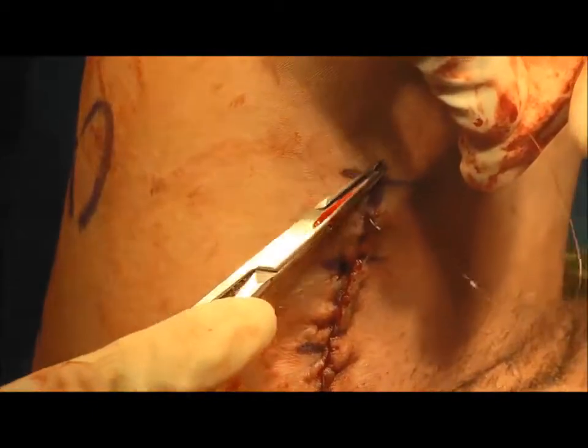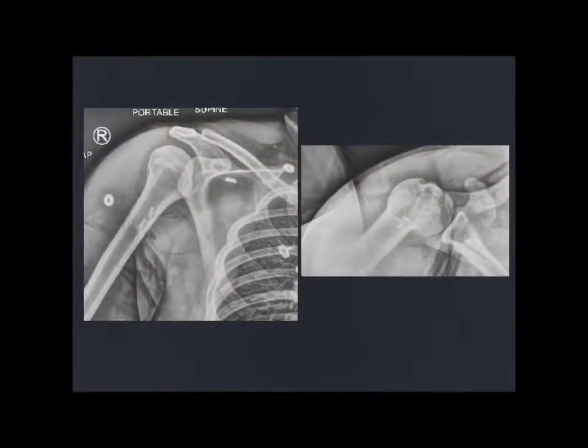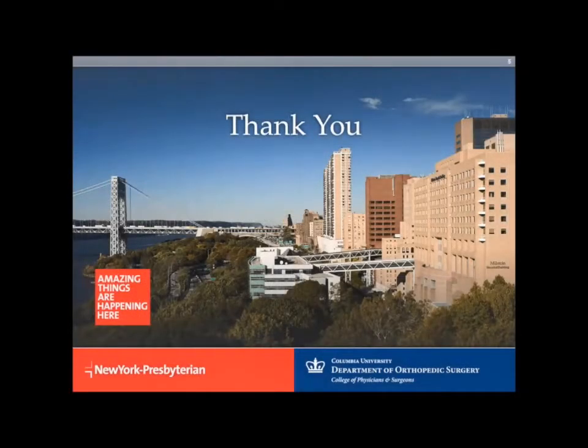Sterile dressings are applied and the patient is placed in a sling. The following are the immediate post-operative x-rays, which show the well-placed cortical buttons abutting the cortex. Rehab begins with passive range of motion exercises at 2 weeks, followed by active range of motion at 6-8 weeks post-operatively.